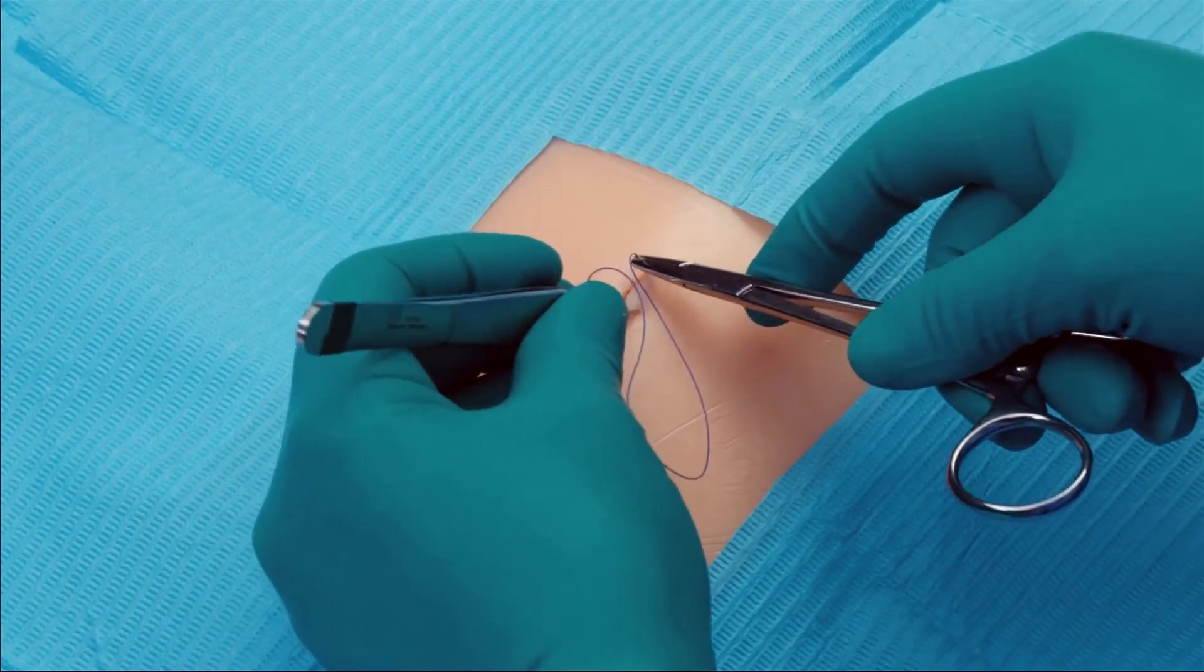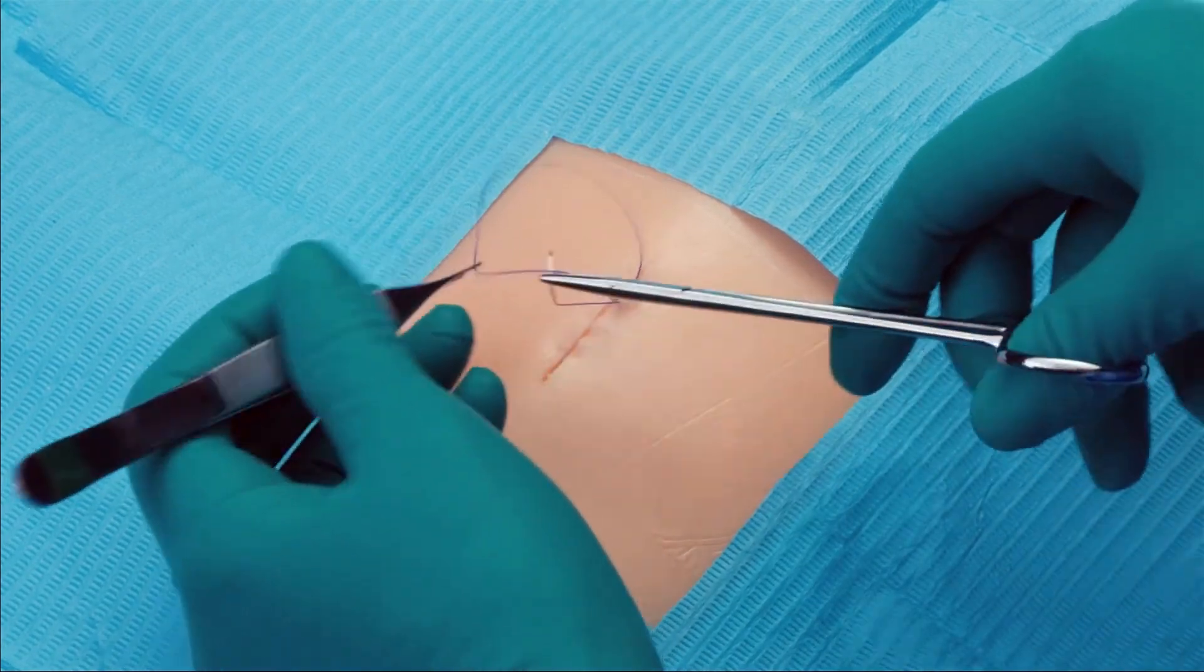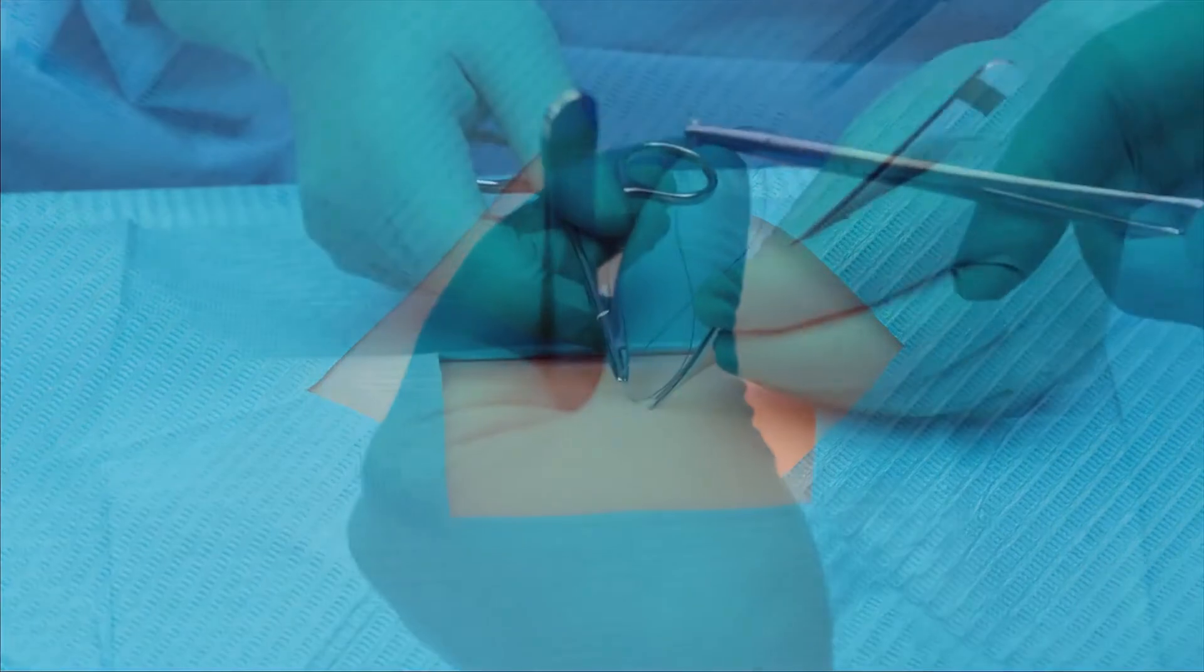It is important to come directly across the tissue line when deploying the device in the subcuticular layer to ensure good apposition.